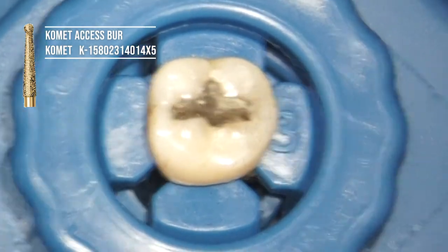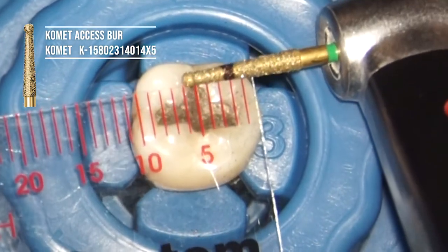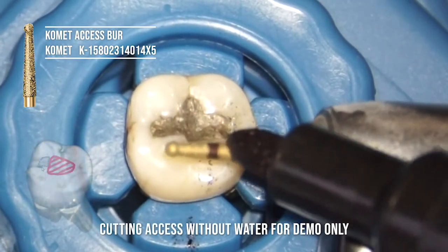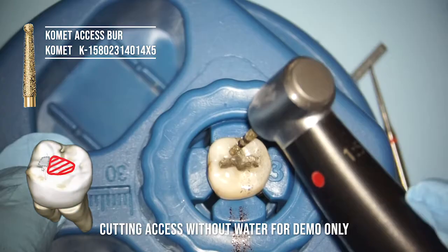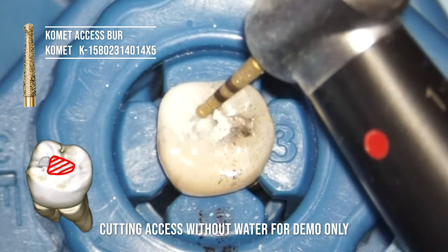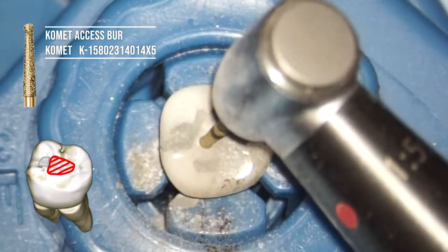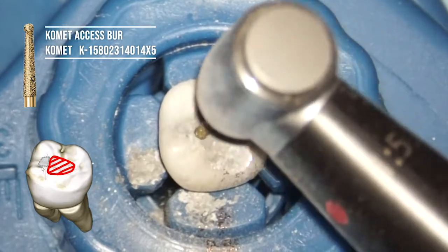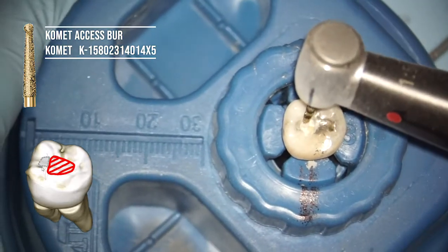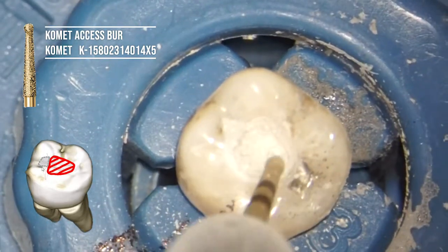This is a really nice burr to start cutting your access cavities from Comet. Actually, Comet have a wonderful range of access burrs. So there's our outline form in the bottom left, just removing that mesial amalgam too. Notice the distal, I should have taken a little bit of distal amalgam out of this prep, which I did not. Removing these amalgams, there's probably caries or some cracks underneath them.